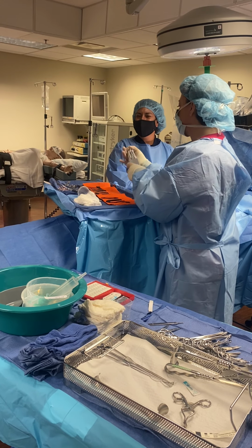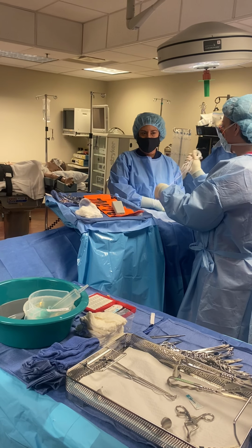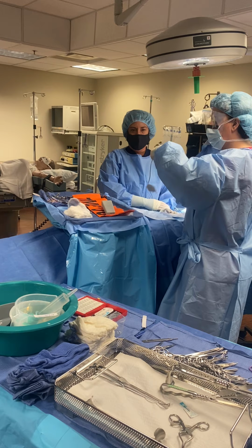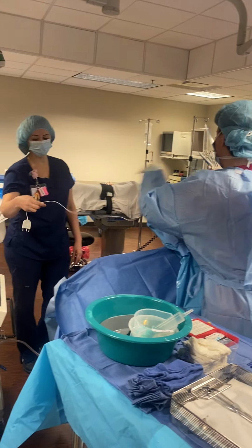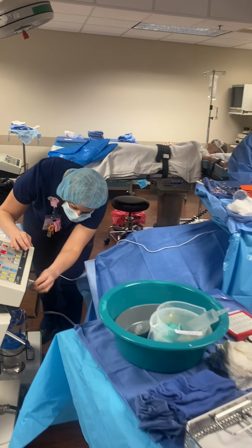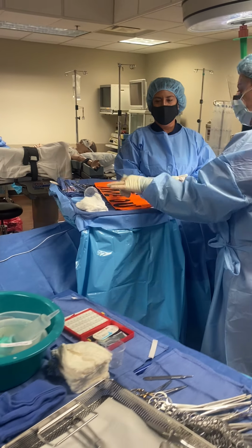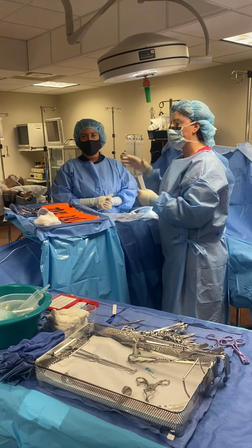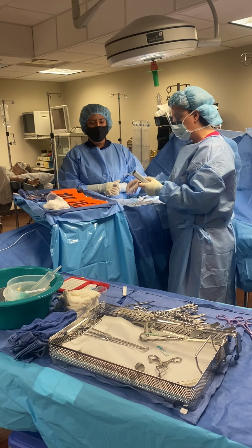So the Bovie's the next one, and I'm gonna do the same thing. I'm gonna keep in my hand closest to my field everything that I want to keep on the field. I'm going to get my 12 to 18 inches worth of distance to my circulator, and if she needs more, I can dish off a little bit more, but again, we'd rather have too much than not enough. And then there's the holster. Bovie always lives in here when it's not in use, right? So it doesn't accidentally get activated or burn a hole or burn the patient or whatever the case may be.